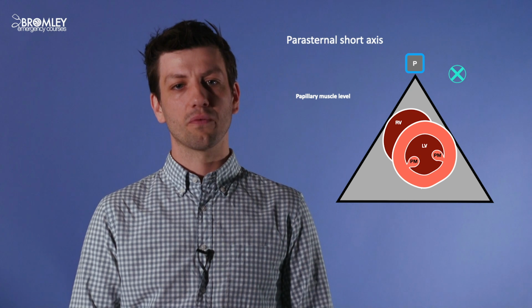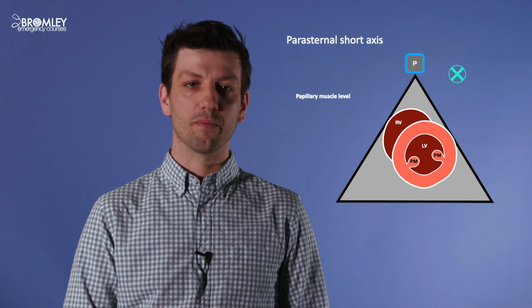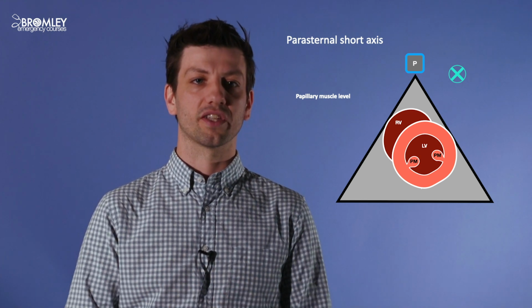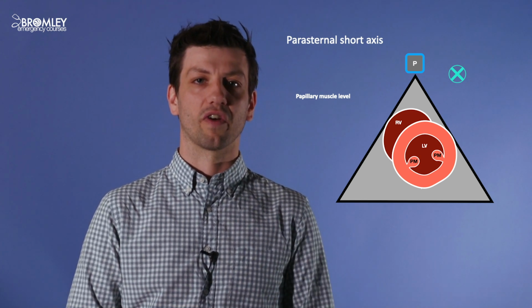As you go further down and cut through at the papillary muscle level, you'll see two papillary muscle bulks, but otherwise the image will be very similar to the mitral valve level.